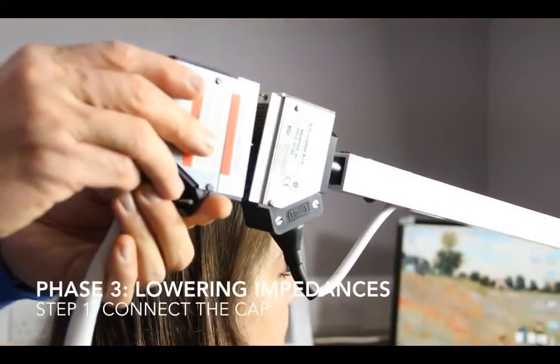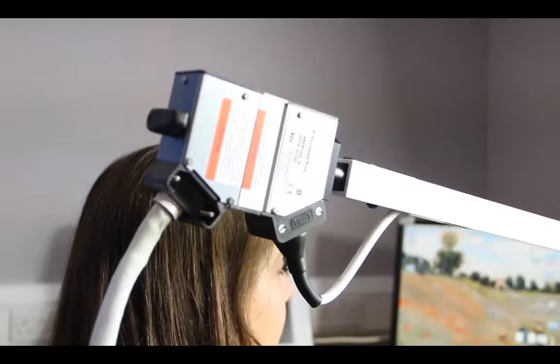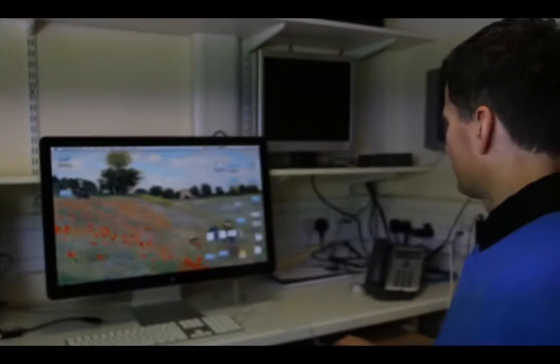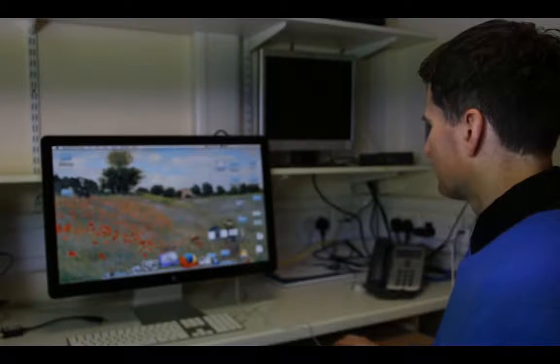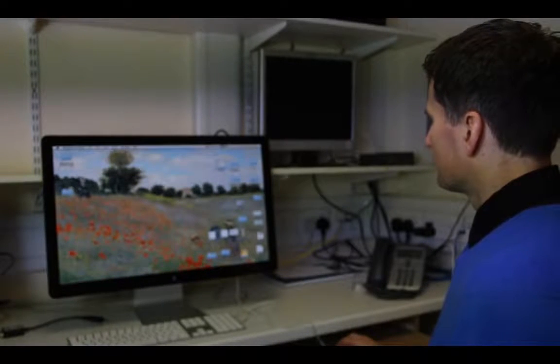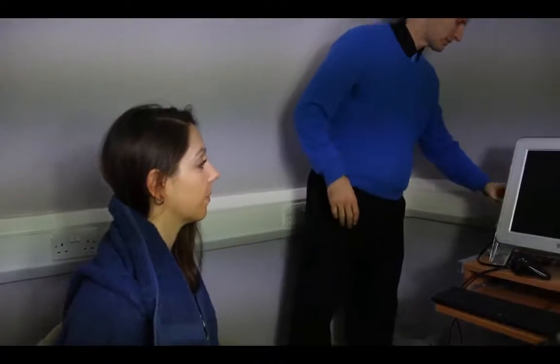The last phase of preparation for recording the EEG signal involves getting the best possible recording from each electrode by lowering the impedances. We start by connecting the cap to the electrical recording equipment. Then, we start the software that's going to be used to record the EEG signal. We want to make sure our participant is very comfortable and that they have everything they need, such as tissues in case water happens to drop on their face, or a towel around their shoulders.